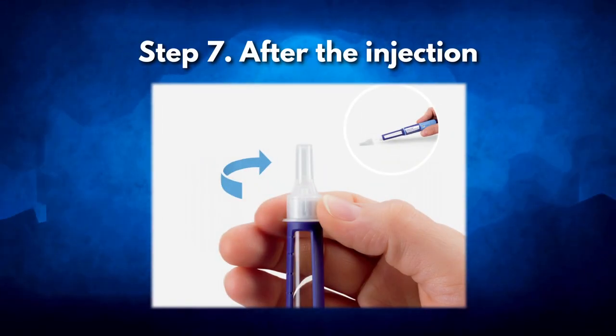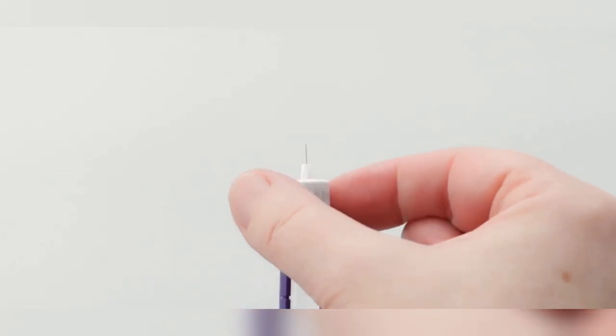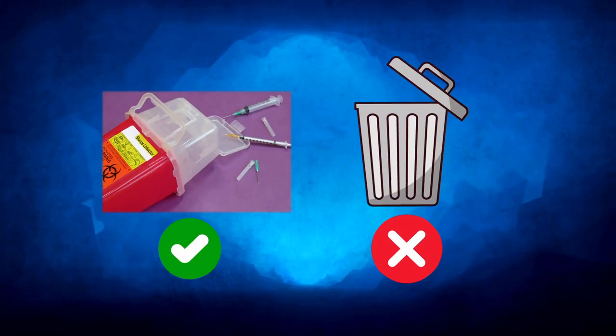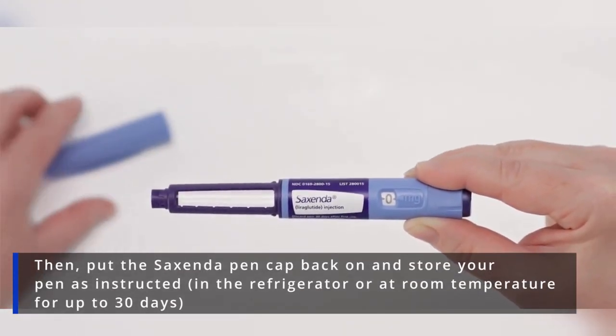Step 7: After the injection. Carefully put the outer needle cap back on and unscrew the used needle to disconnect it from your Saxenda pen. Dispose of it in a sharps container — never in the household trash. Then put the Saxenda pen cap back on and store your pen as instructed.